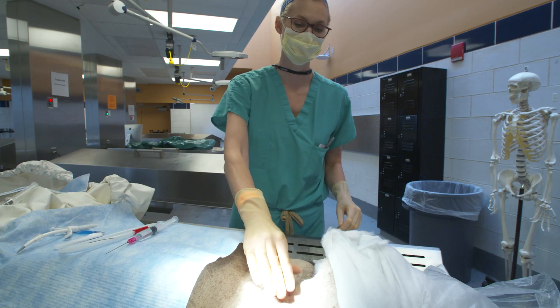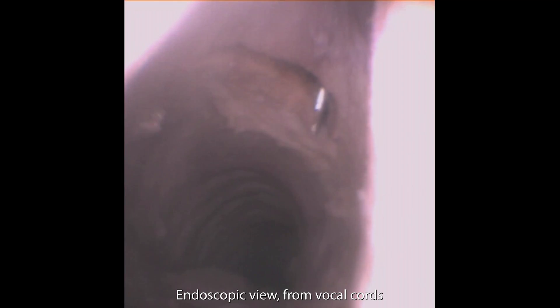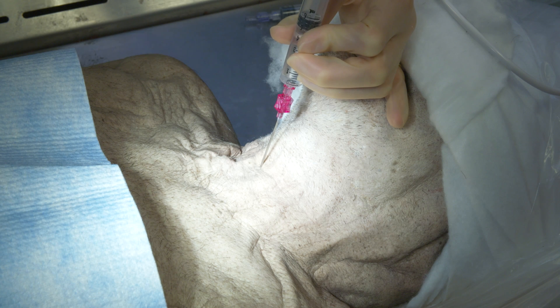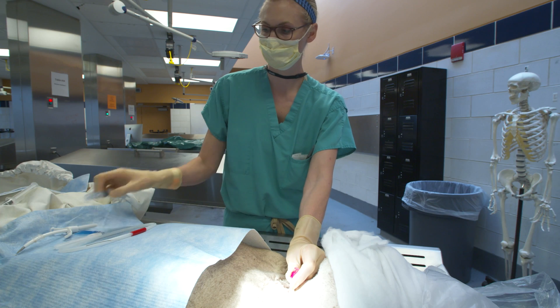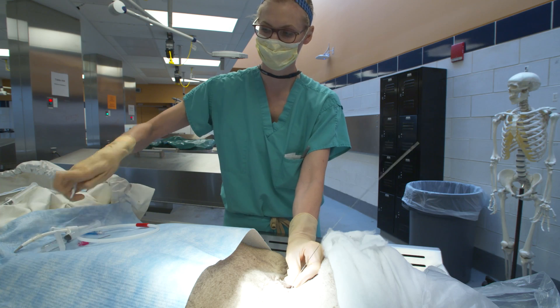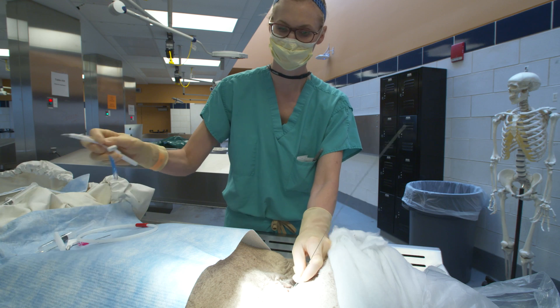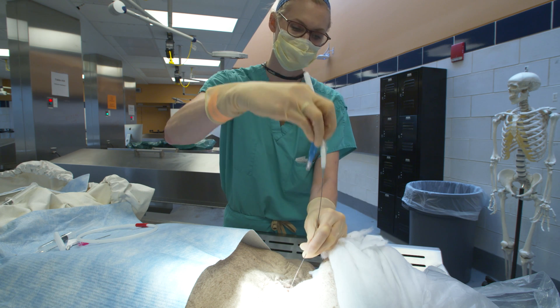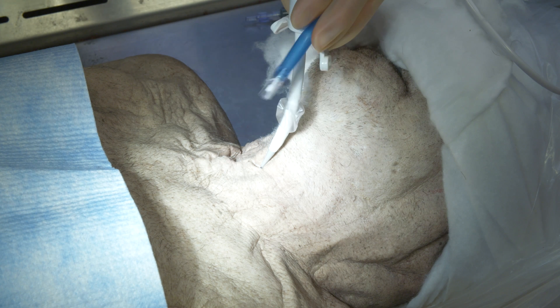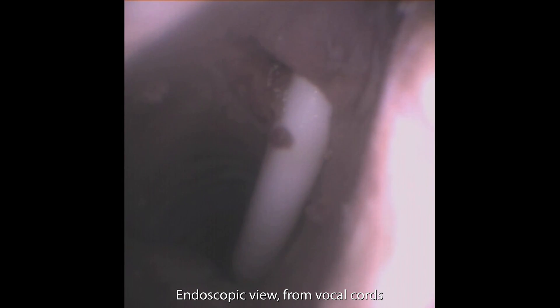Set up your equipment within easy reach and quickly prep and drape the area if time allows. First, locate the cricothyroid membrane and keep your finger over the area. Using the trocar needle and syringe, puncture the cricothyroid membrane while pulling back on the syringe. When you break through the membrane, air will be easily pulled back through the syringe. Quickly remove the syringe and advance the wire through the needle — your patient may cough with this maneuver, which is normal. Remove the needle and hold the wire securely in your non-dominant hand. Next, make an incision with your scalpel at the wire entry point horizontally through the skin and cricothyroid membrane. Advance the cricothyroidotomy tube with its integral dilator over the guide wire, pointing the tip inferiorly at the skin incision and advancing it along the wire using a curved smooth motion. If it is difficult to advance through the skin and tissues, use your scalpel to make a larger incision.